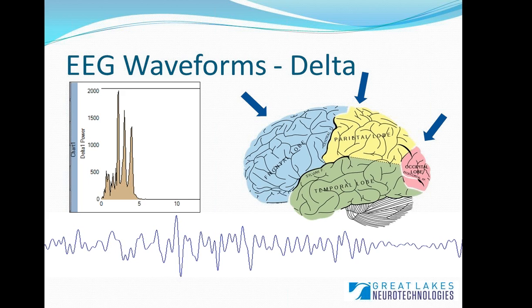It is the level of complete relaxation where no dreaming is occurring, and the activity of the brain is just so slowed and so low, where the frequency of the signal is usually below 4 hertz. And so in the image here you can see the peak occurring maybe at about 2.5 hertz.